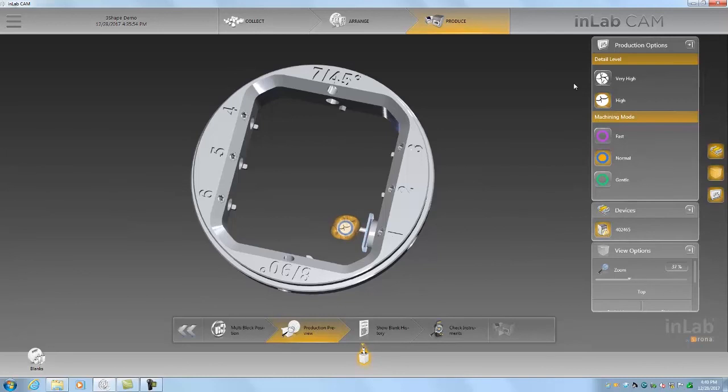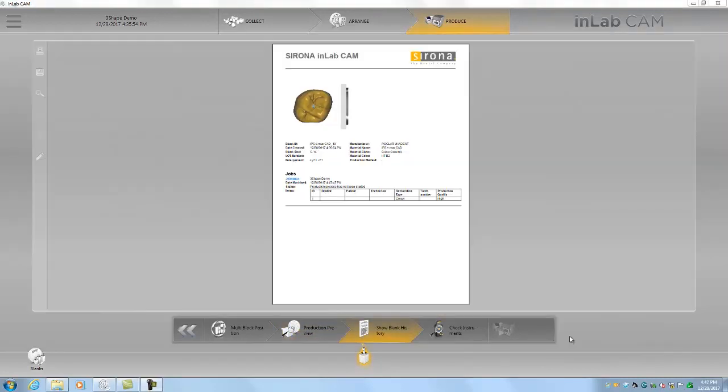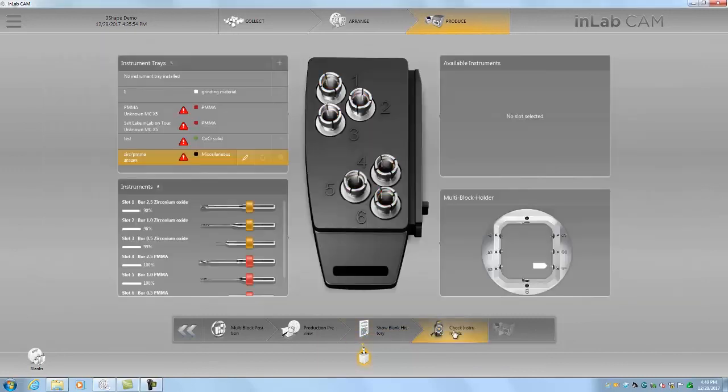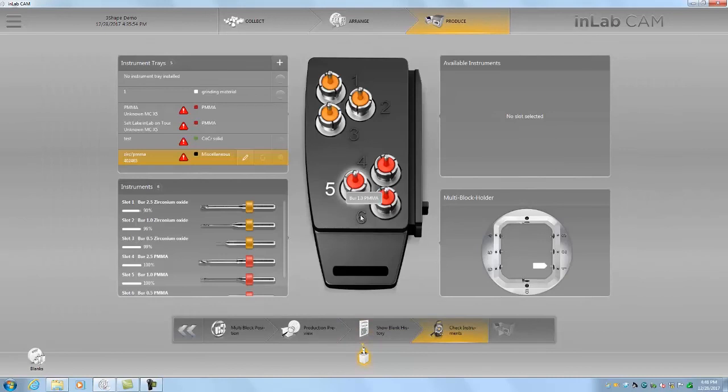And yep, we'll keep going forward here. So here is our milling report. If we want to print this out and keep it with the job, we can do it here. We're just going to go to the next step, which is to check the instruments or the tools that we're going to be using.